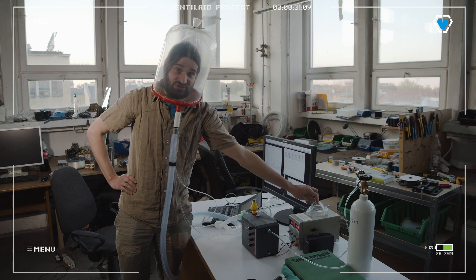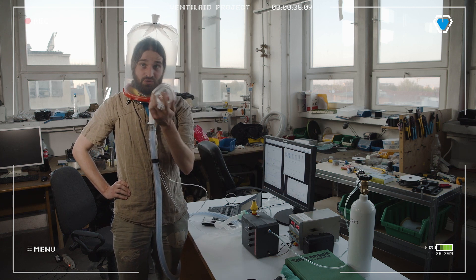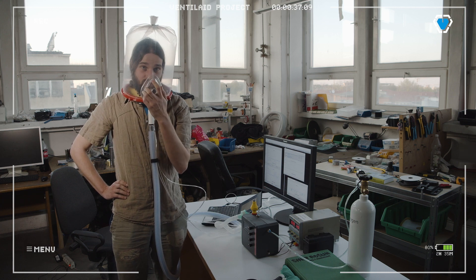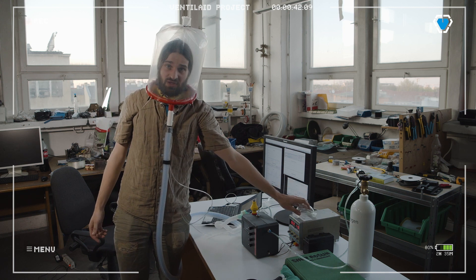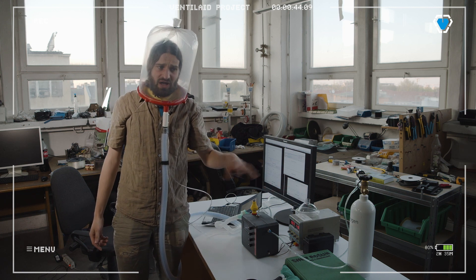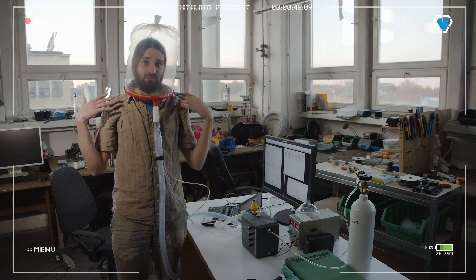If you have the masks, even if you are a healthy person and you just wear it for a few hours a day as me, you soon start to find it painful around your nose. So what they came up with in some highly problematic COVID areas is that you could be putting helmets on.